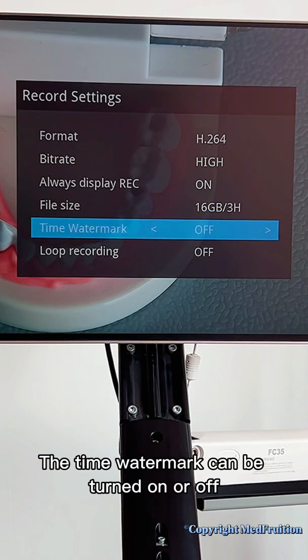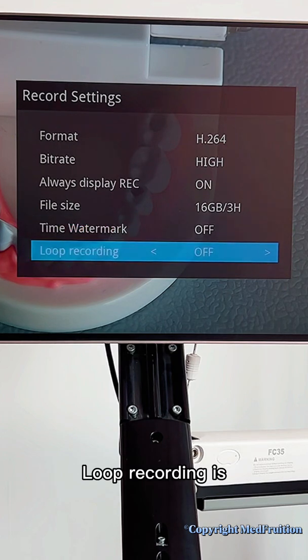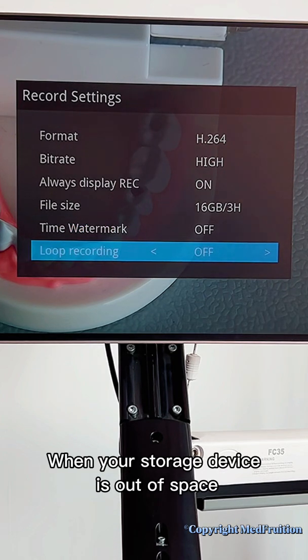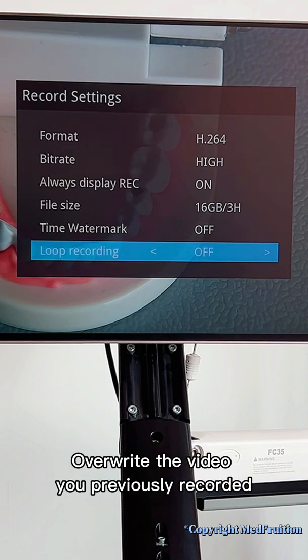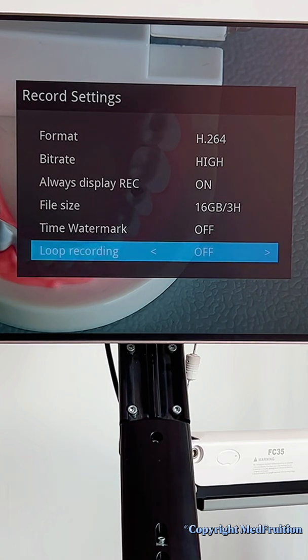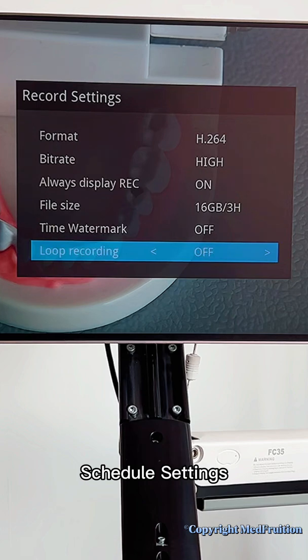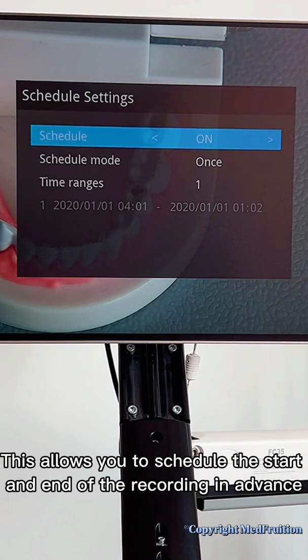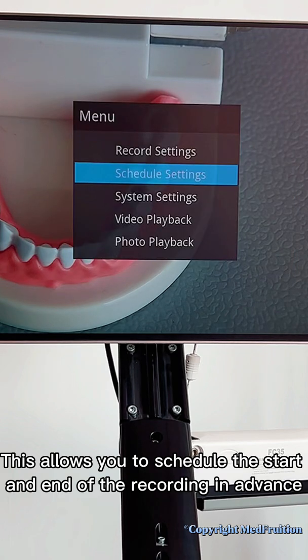The time watermark can be turned on or off. Loop recording is when your storage device is out of space — it will overwrite previously recorded video. Usually select off. Schedule settings allow you to schedule the start and end of the recording in advance.